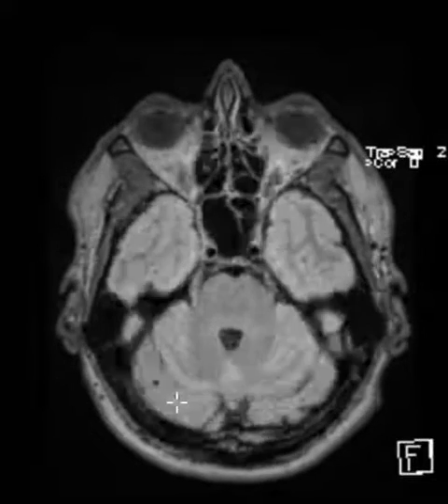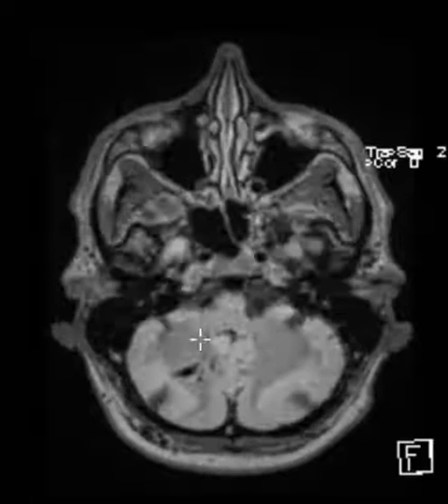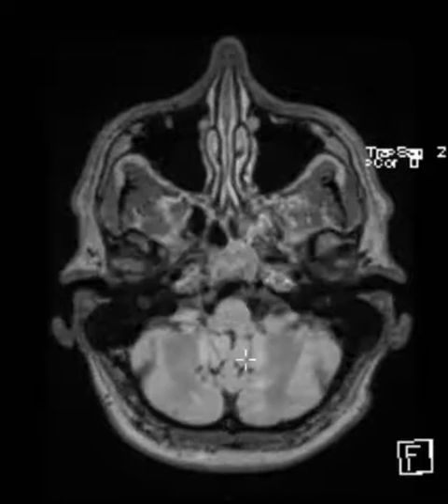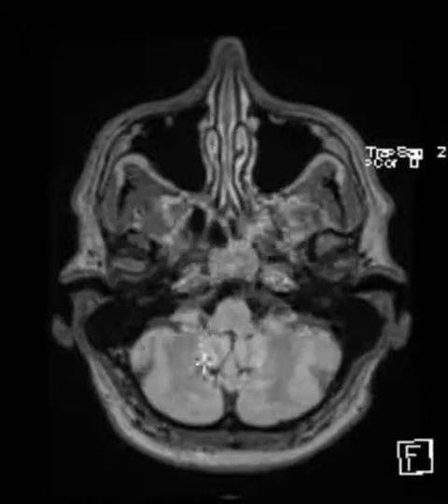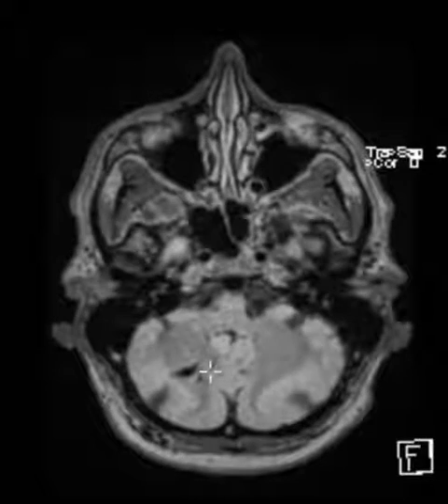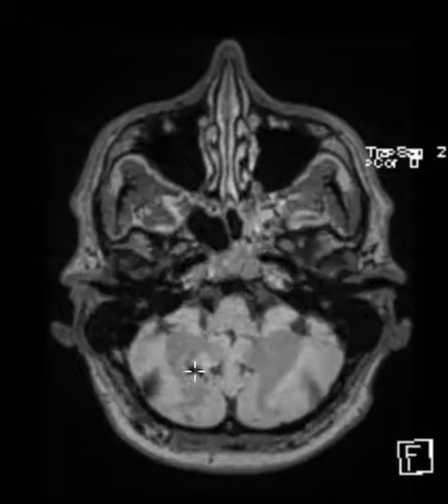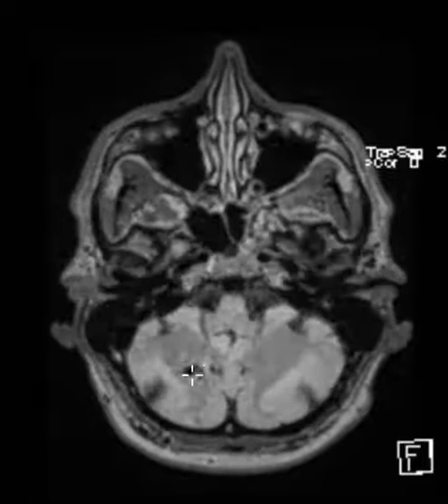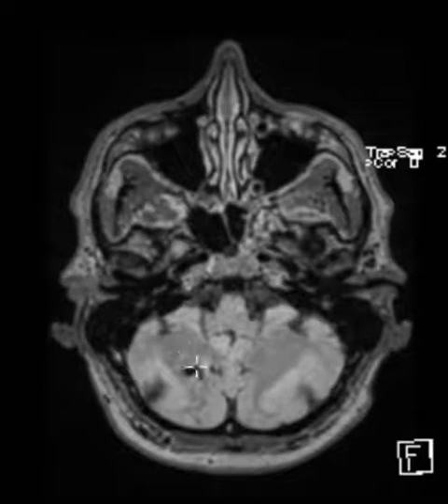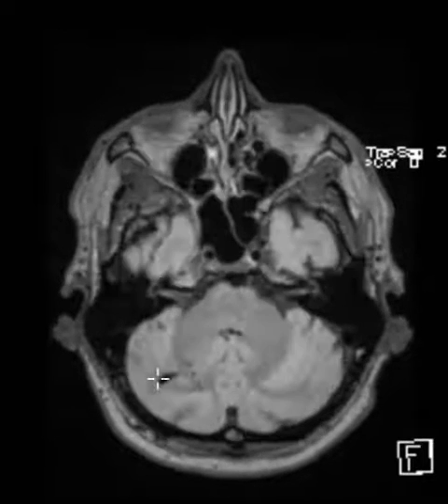Usually these have several smaller veins that drain into them, and they call it the kaput medusa sign. It looks like Medusa's head with snakes — these little blood vessels coming together to converge into the dominant vessel. Or you can call it palm tree appearance, where it looks like palm branches coming into the palm tree.